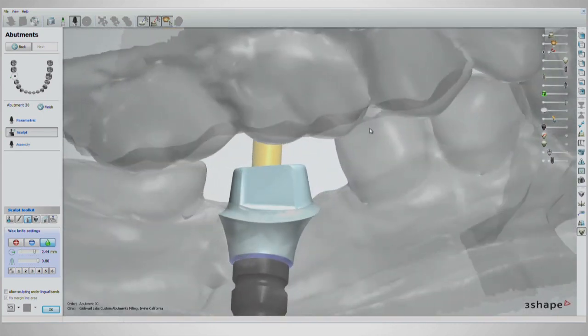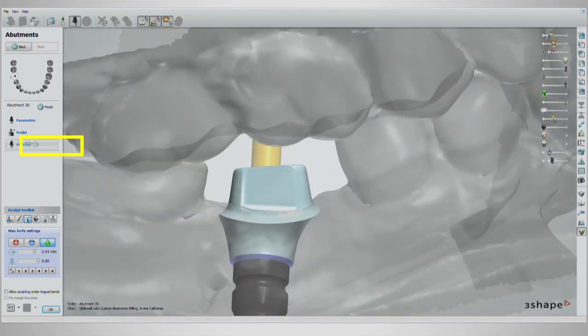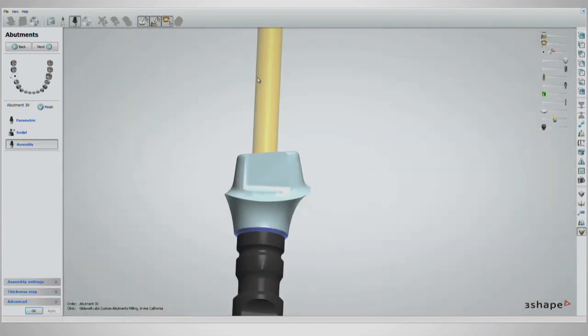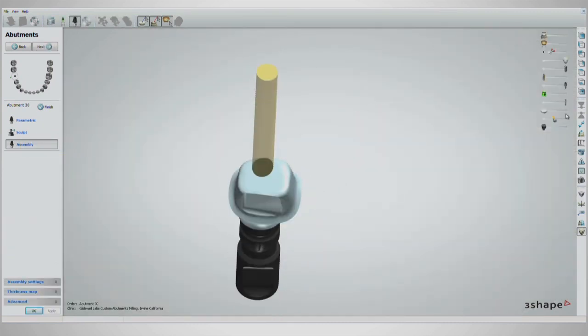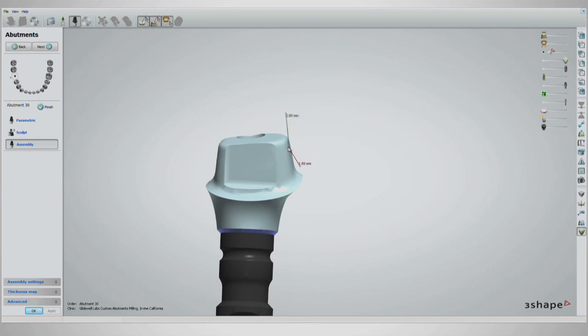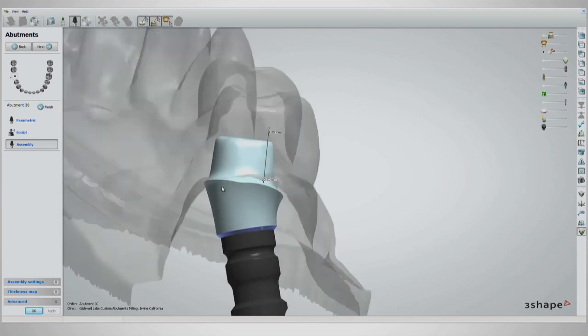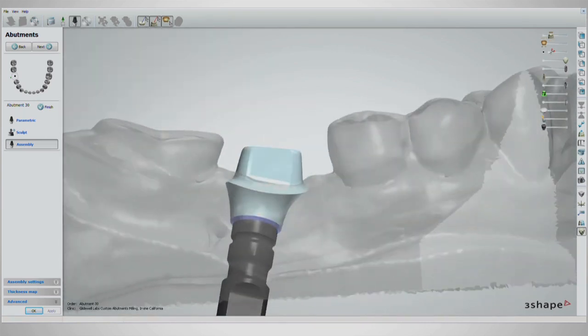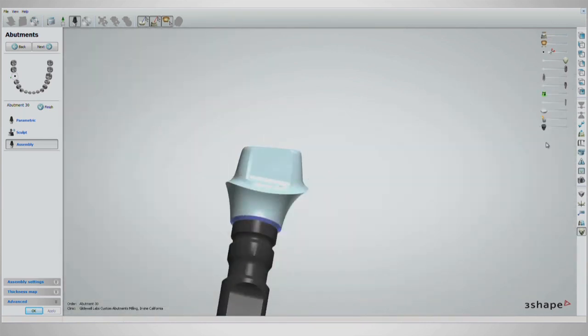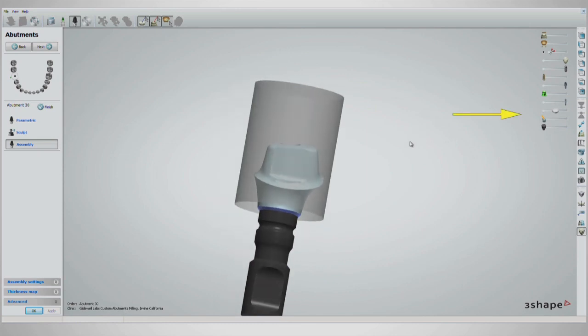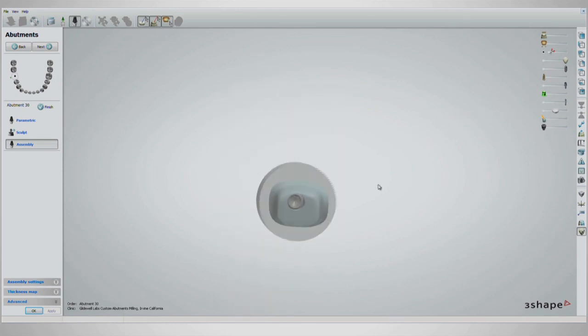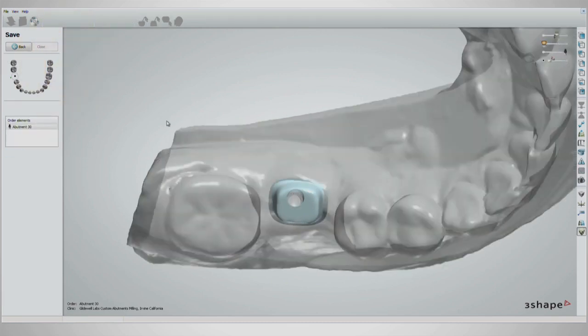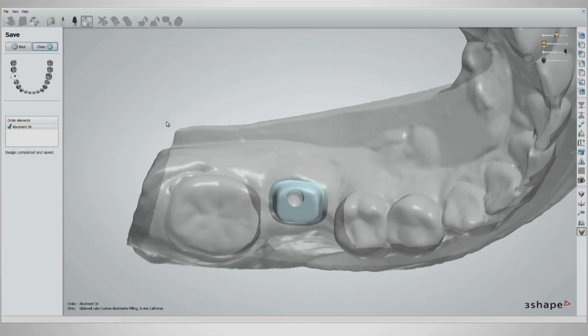After the sculpt stage, access the assembly stage, where the program combines your moves from the parametric and sculpt stages with the access hole. Here you can double check your design by using the milling blank handle to make sure your design is within the millable area. Once satisfied with the design, click next on the upper left to generate the millable file. Then click close.